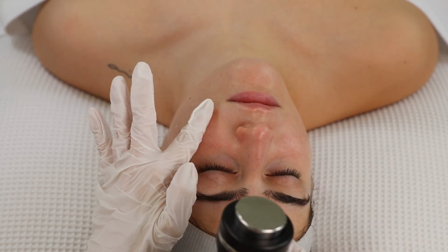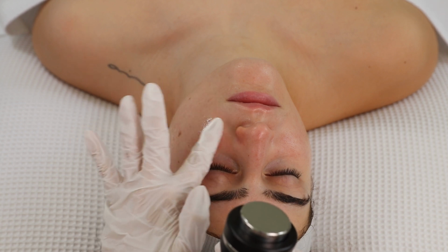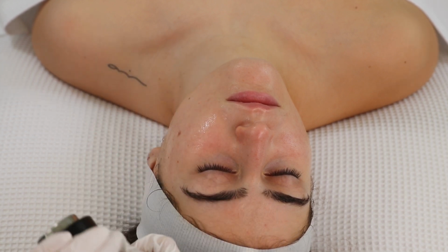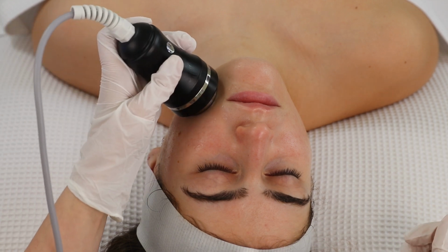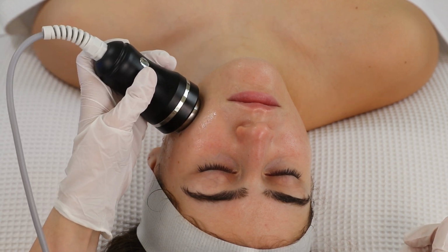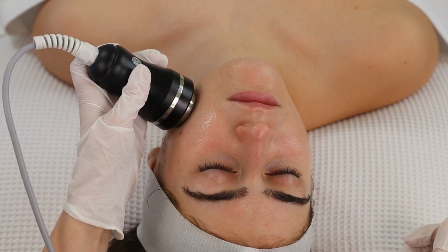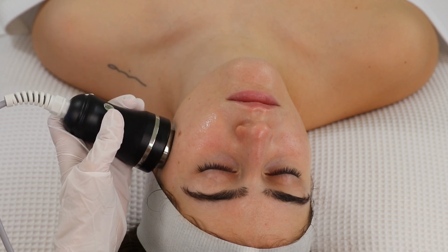We're going to apply 3 drops of the serum, spread it across evenly with one of our fingers, and then carry out the no-needle mesotherapy. The ultrasound probe actually has the ability to penetrate all the way down to the dermal layers of the skin, and that pushes the serum into the deeper layer of the skin, which again completely optimizes the results of this treatment.